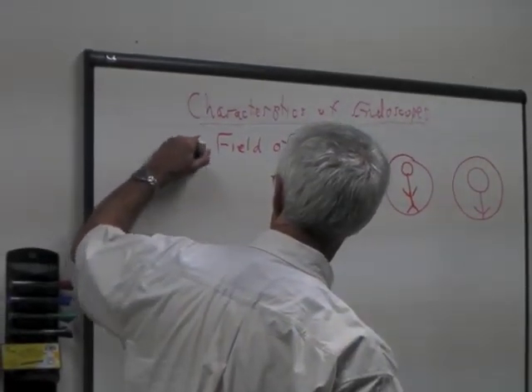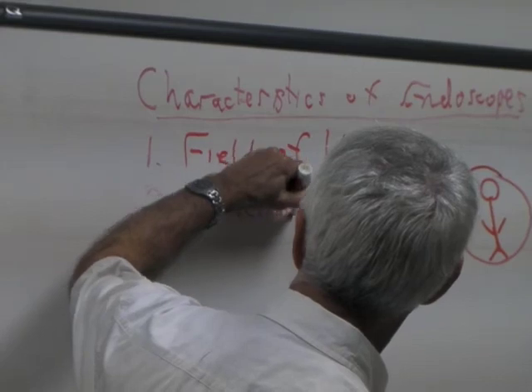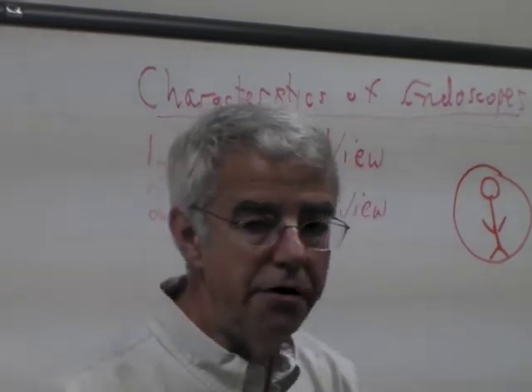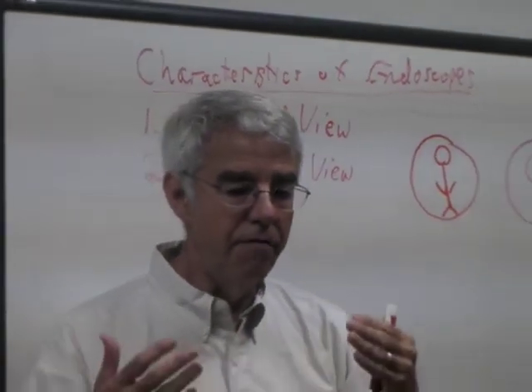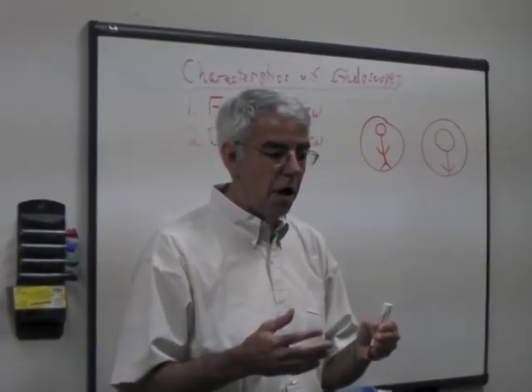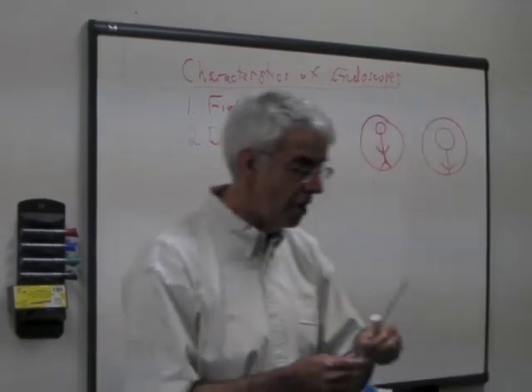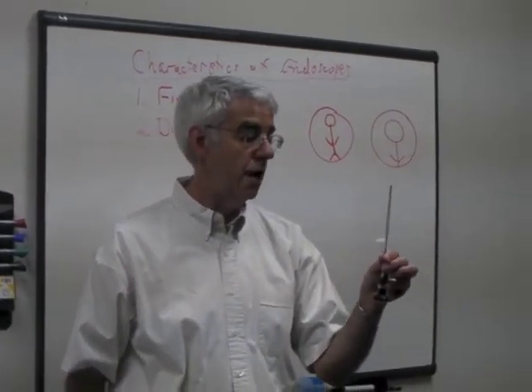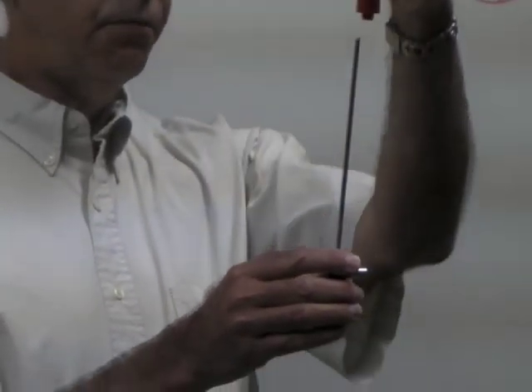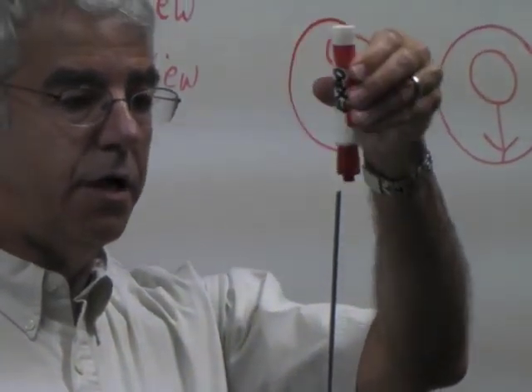The second characteristic that's really important is direction of view. This is in a way similar to field of view, where it's not a figure of merit. It's something that the surgeon needs to have consistency. You'd think it would be pretty straightforward. This particular arthroscope that we're looking at is a 30 degree direction of view, which means that the angle between the axis of the endoscope and the center of the field of view subtends an arc of 30 degrees.